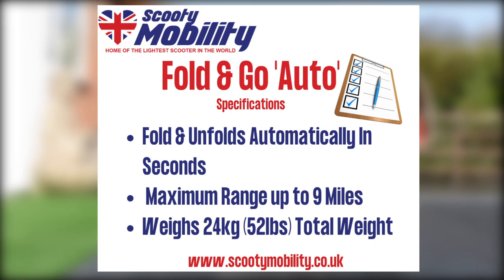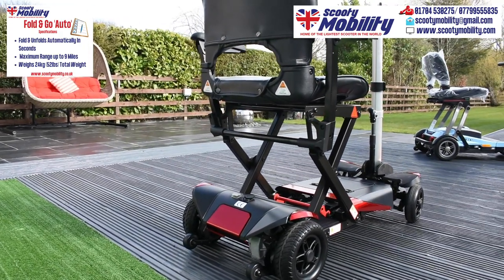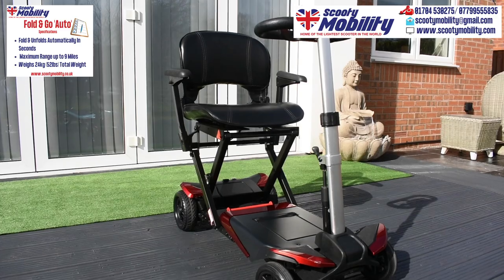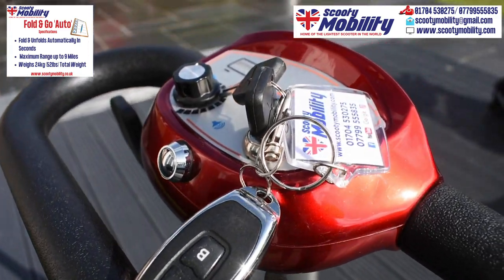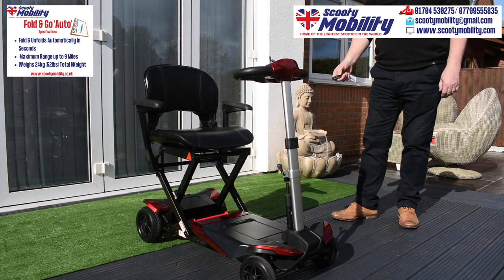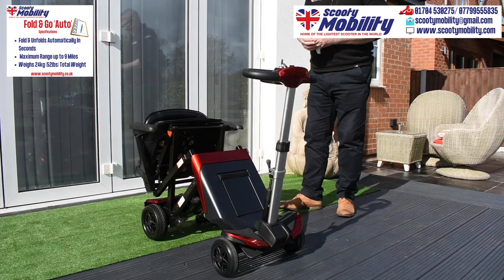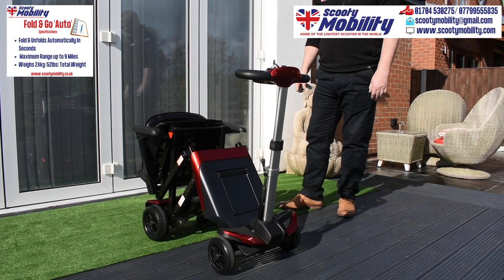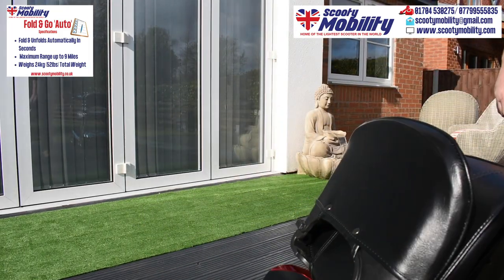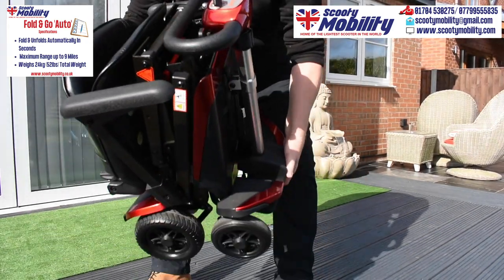So here we have the Auto Fold — a fabulous scooter, we sell a great load of these. It folds up automatically with the press of a remote control on your key ring. It weighs around about 27 kilos, so obviously it's heavier than the Scooty, but still manageable. Here's the little remote control — press button A and it will start unfolding. It stops halfway as a safety feature in case a child or pet got underneath it while folding, so you need to press the button a second time. You can wheel it around like a suitcase. Very manageable, very comfortable, full four wheels. It's got a range of about 8 miles.